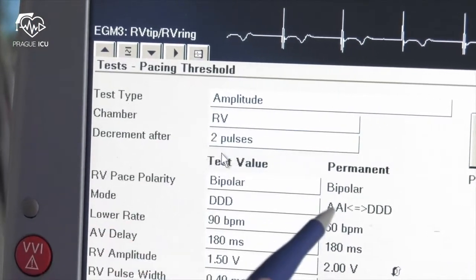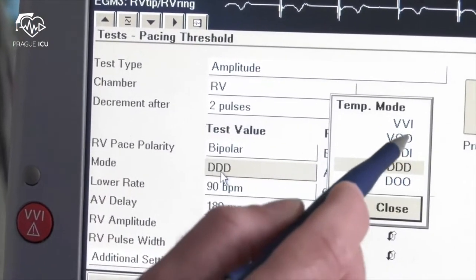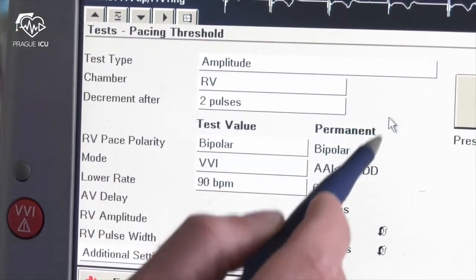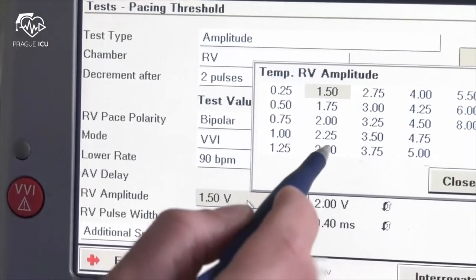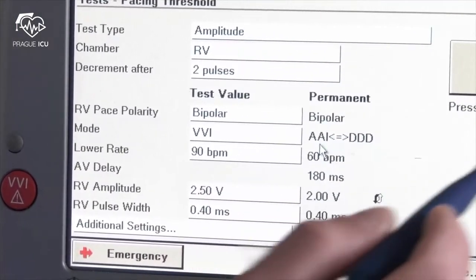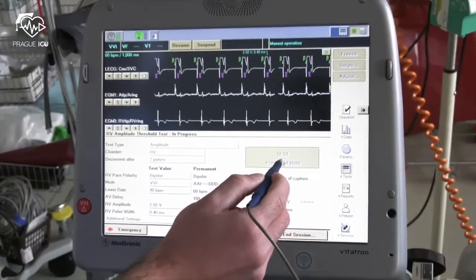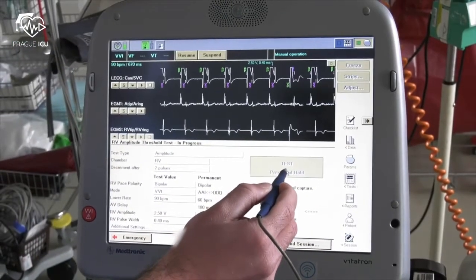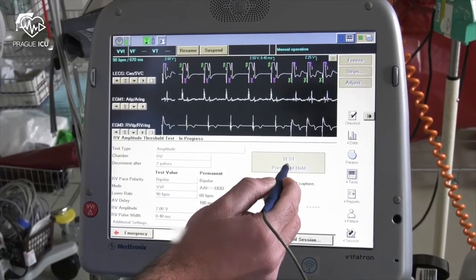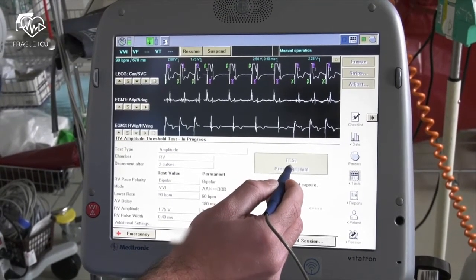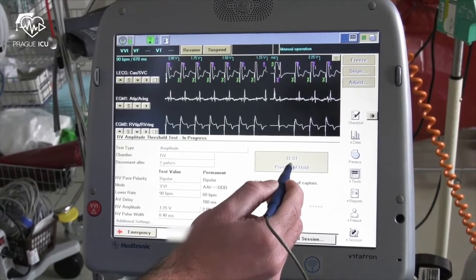For the threshold test in the ventricle change the chamber to RV, pacing mode to VVI, and repeat the same operation as in the atrium test. In the upper part of the screen observe the pacing test and release the button when you see no capture in the ventricle.